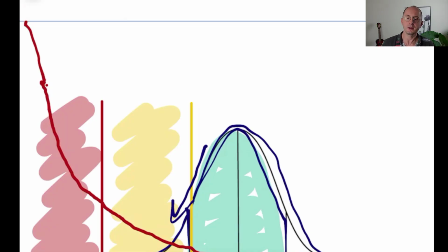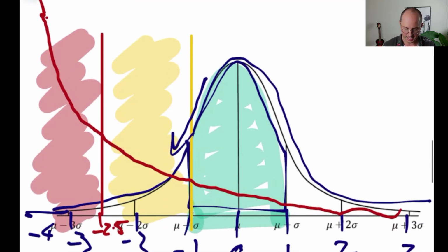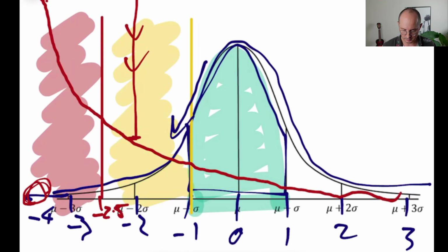Okay, so then when you move from that score of -4, your risk is up here somewhere, right? It's up here. So if we kind of do a line across to there, and then if we move to a -2, your score is about here. And that right there represents the drop in your relative risk when you go from a -4 over here to a -2 over here. All right?